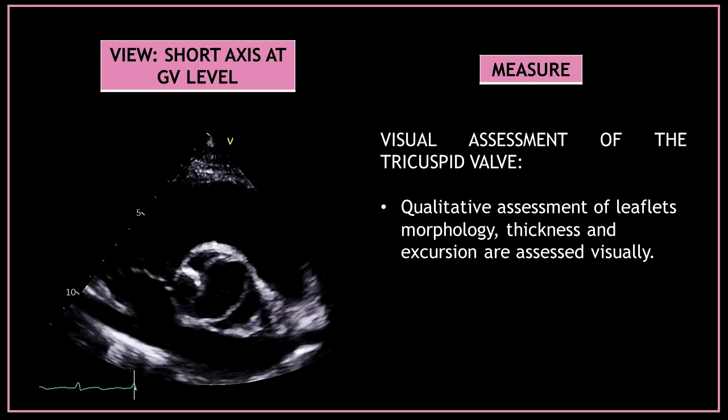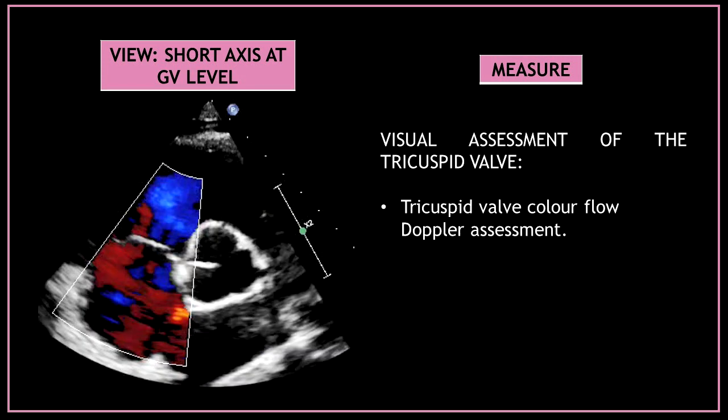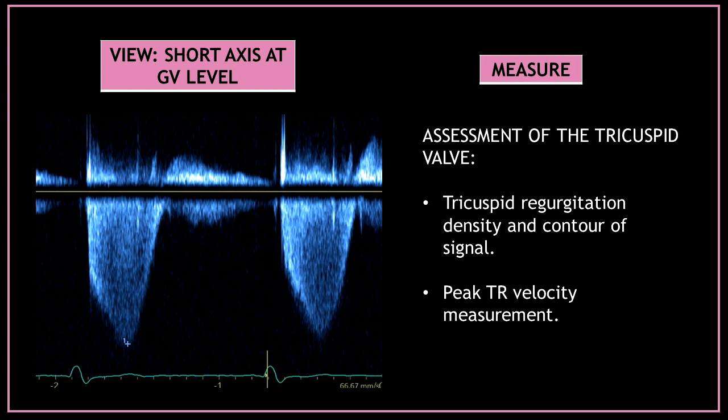Now let's move to the tricuspid valve and do a visual assessment of the leaflet morphology, thickness, and excursion. Use color Doppler to assess the color flow across the tricuspid valve. Finally, use continuous wave Doppler across the tricuspid valve — assess the tricuspid regurgitation density and contour of the signal, and measure the peak tricuspid regurgitation velocity.